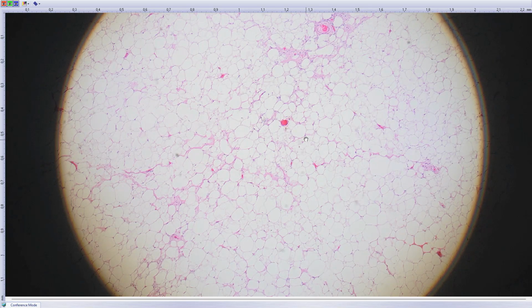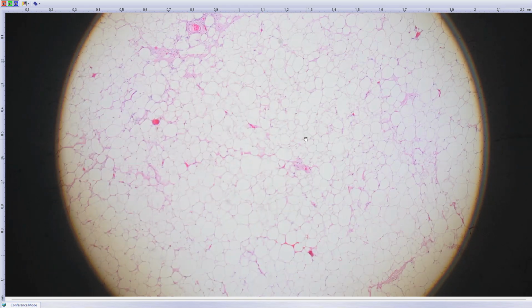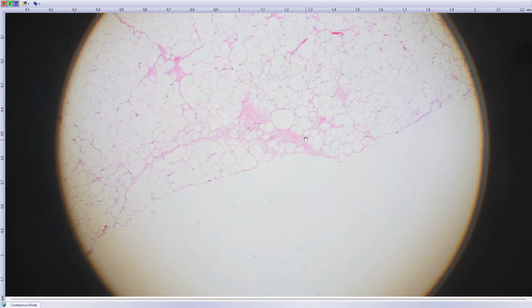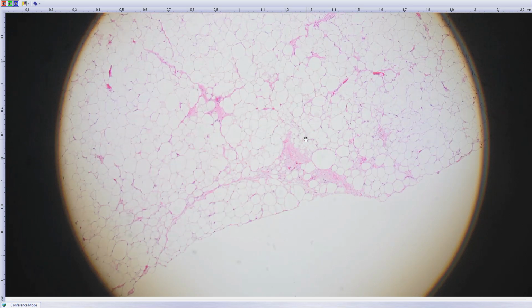And at the end, two very easy, common general surgical pathology cases, which are, however, problematic for general surgical pathologists because they don't see this so often. So this is an 80-year-old lady with a tumor around her scapula, approximately 10 centimeters in diameter.